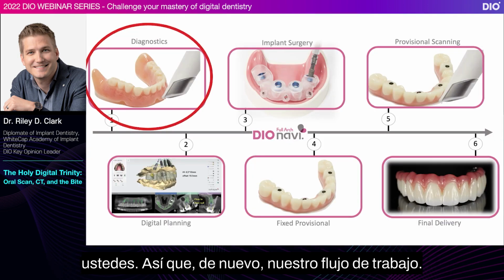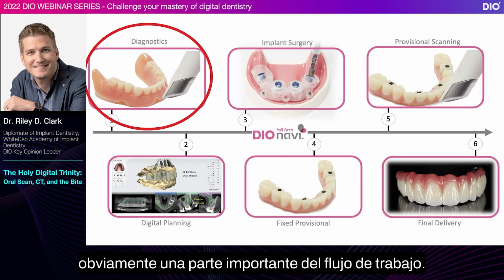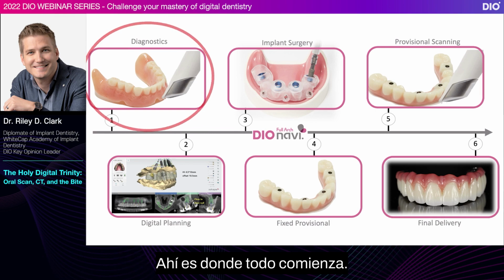So this is again our workflow. If you watched my webinar last week, you saw me show this workflow, step 1 through 6. Each of these steps is obviously an important part of the workflow, but step 1, the diagnostic step, is obviously where the tire meets the road. That is where everything gets started.